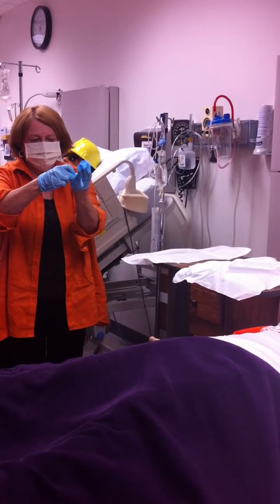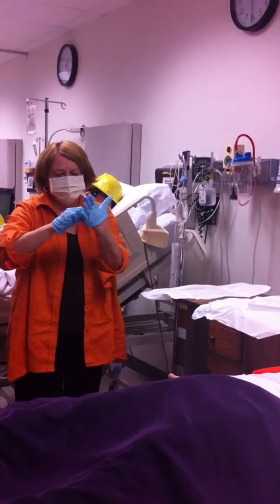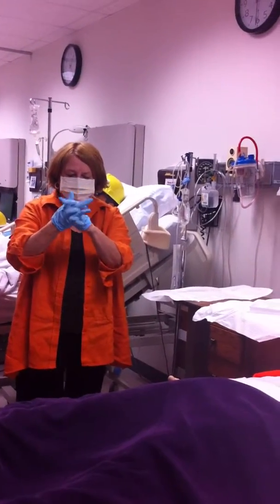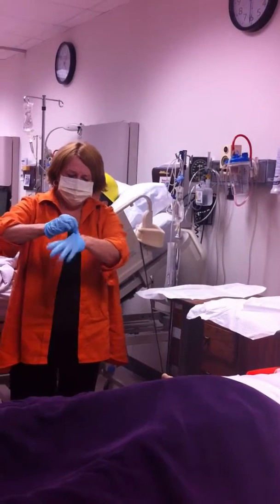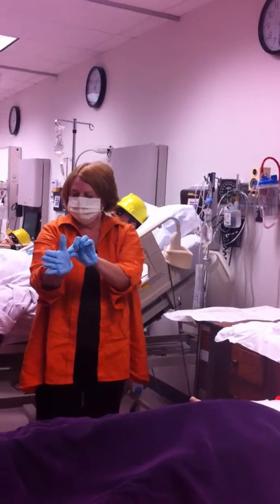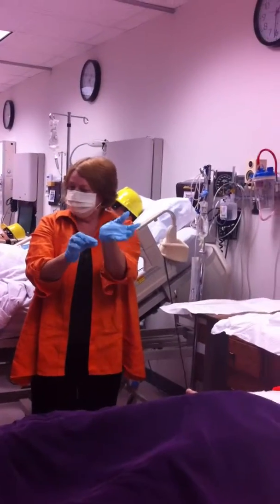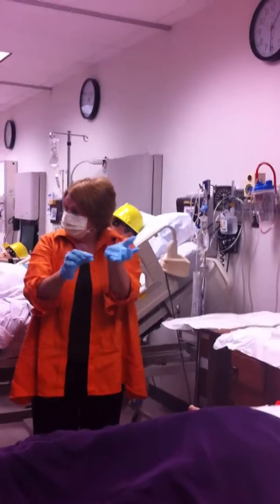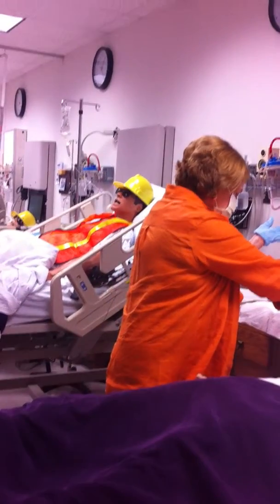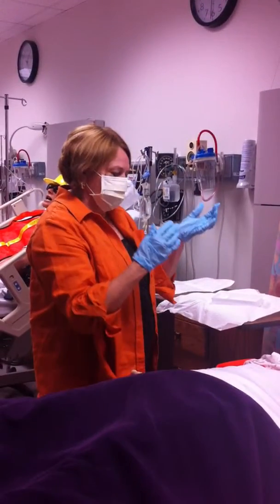Okay, I can adjust this glove with the palm and the fingers. I'm not real crazy about that. But I can't touch an inch here, can't touch an inch down here. That's defined as non-sterile. Okay, if you choose, you're going to look at your wound, and then you're going to choose what you're going to clean with.